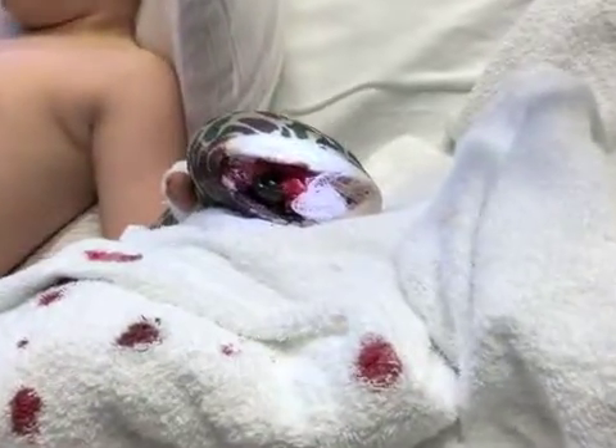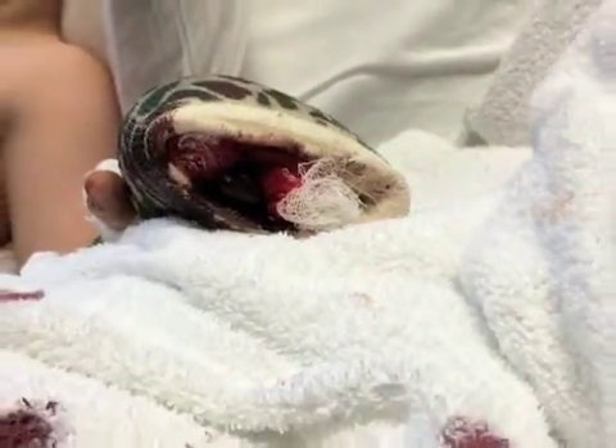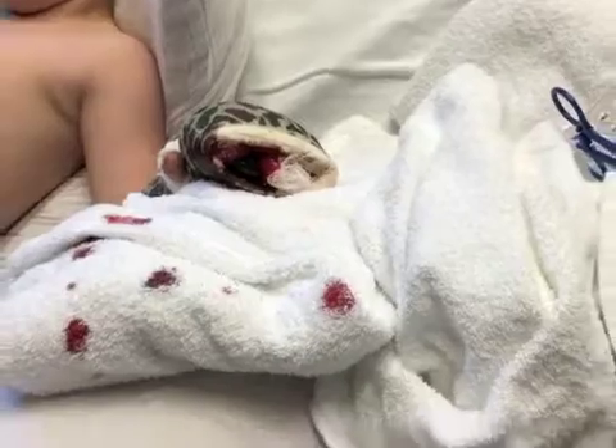If the leech does not detach after one hour, stroke the leech gently with alcohol or use Vaseline until it drops off. Then pick up with forceps and discard. Do not pull the leech off the skin with force.